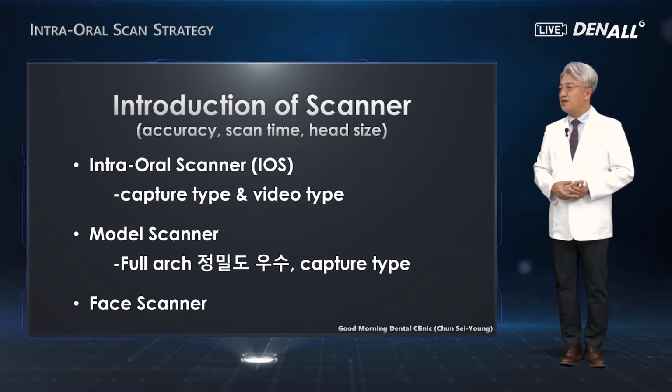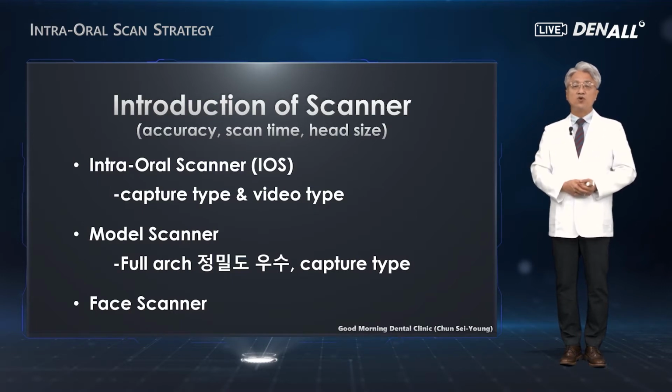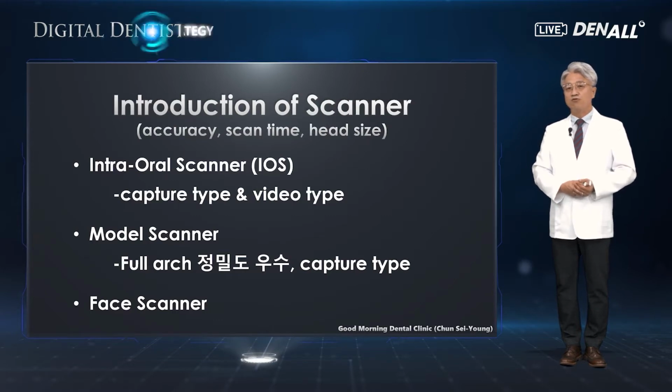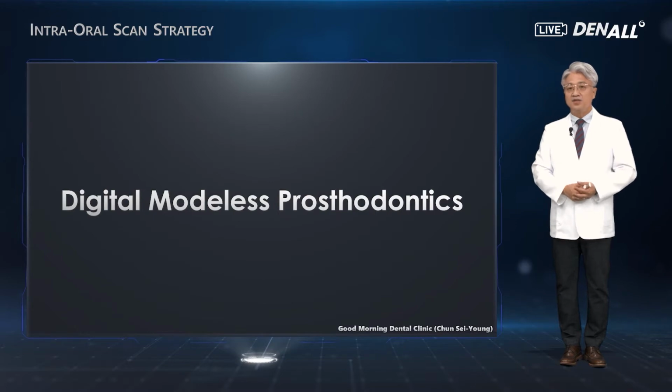Next is the face scanner. The 3D CT, the oral situation, can be captured with intraoral scanner or model scanner. Using a face scanner, you can utilize three-dimensional face information for denture patients, for anterior aesthetic prosthesis patient, or orthognathic surgery. It has the advantage of providing digital simulation. So a lot of research is going on for face scanner, and soon I believe it will play a bigger role in our clinical setting.